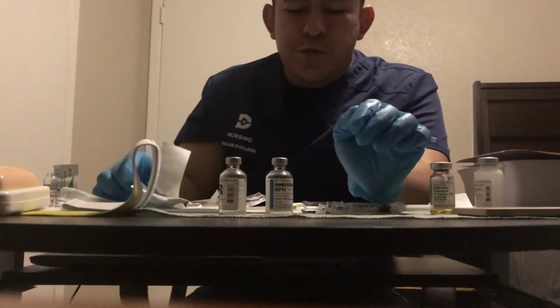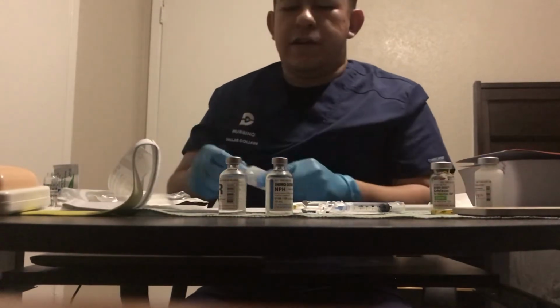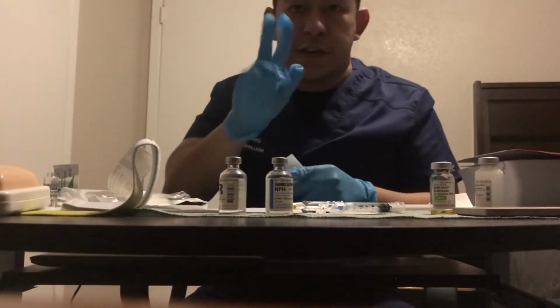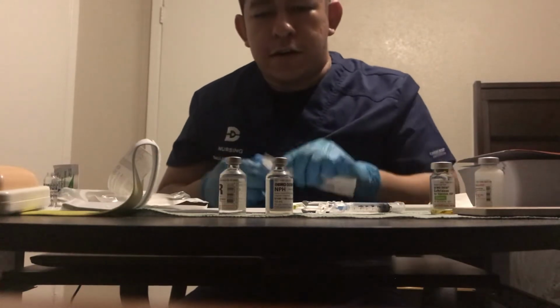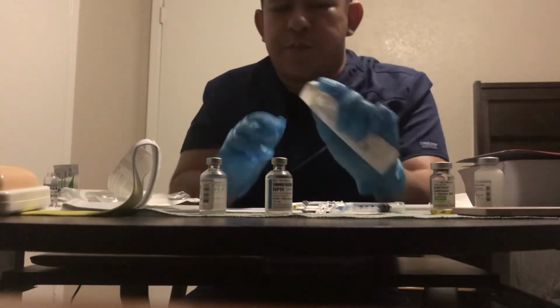Next up, we're going to prepare our insulin. So for insulin, and this is our third check for insulin, second check for insulin as well. This is indeed NPH. We got regular. It's for Jack Buzzard.